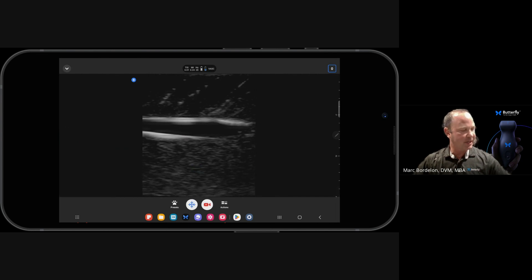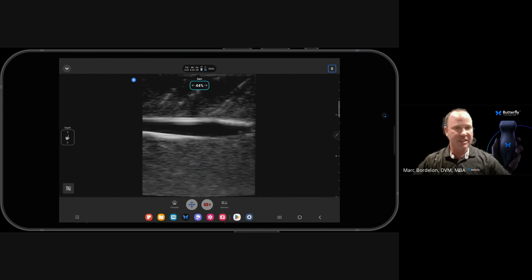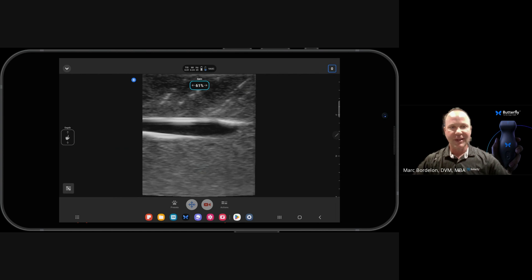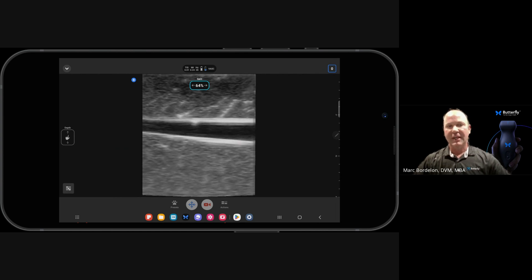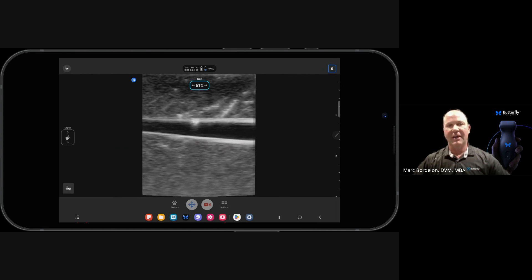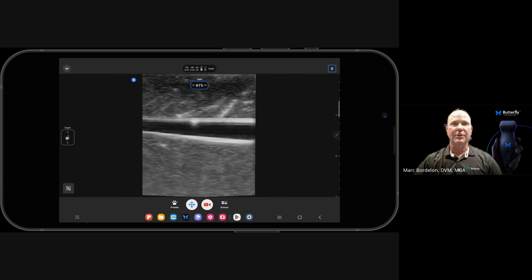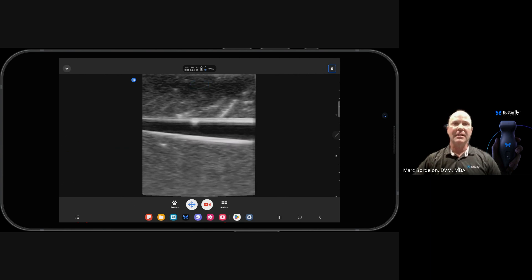And then my last step is going to be just to adjust my gain to an appropriate amount until I feel like I have an optimized picture. And those are the steps in optimizing an image when using the Butterfly app.